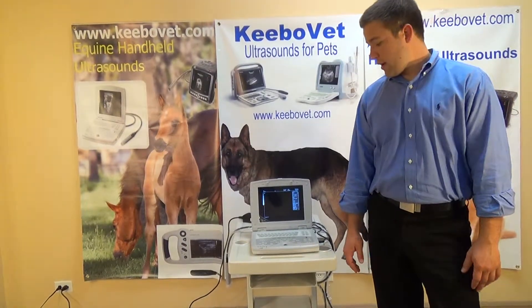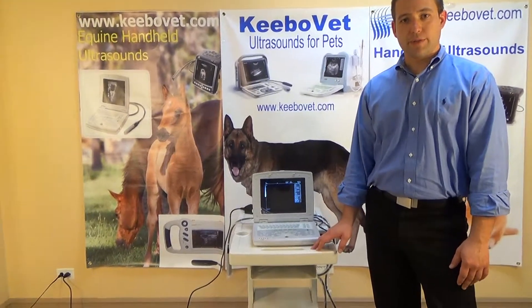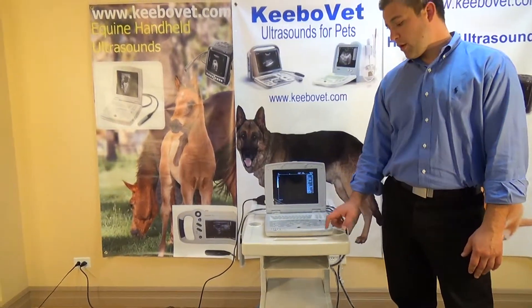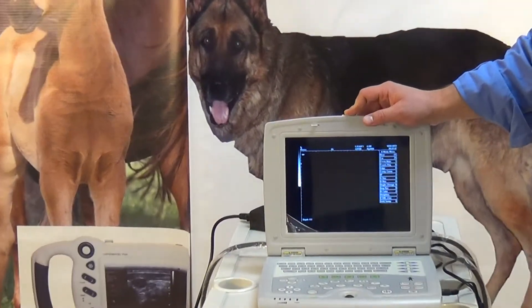Alright, this is Theo again from CuboMed, and we're here to show you our KX5000 Ultrasound Machine. This is our most reliable, affordable, and best-selling portable laptop version of the Ultrasound Machine.